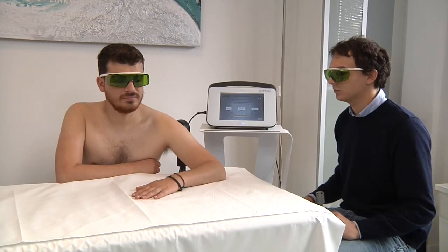The third phase of treatment has a purely antalgic target. We still use the small spacer. The mode is the superpulsed. The treatment point is the one with the greatest pain indicated by the patient.